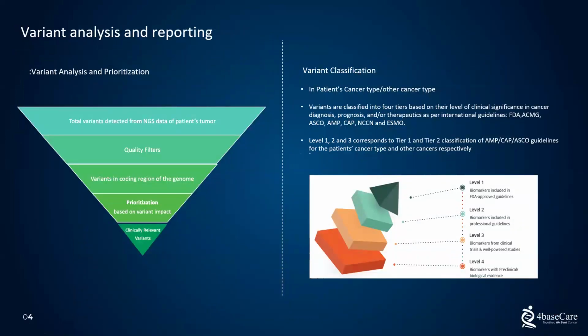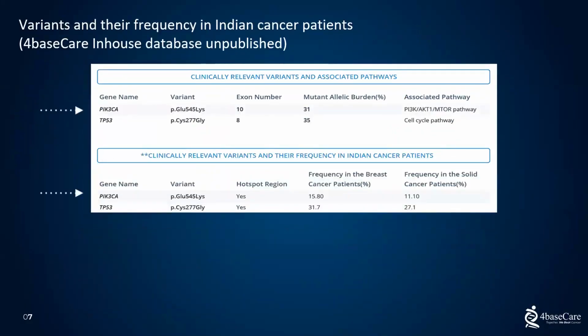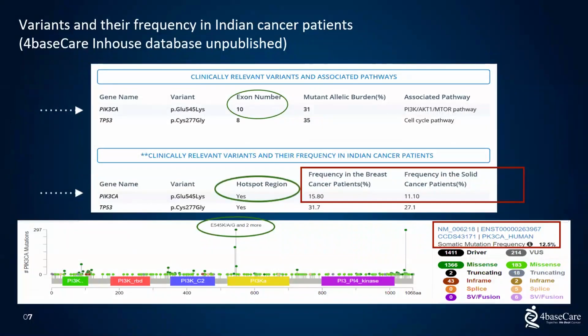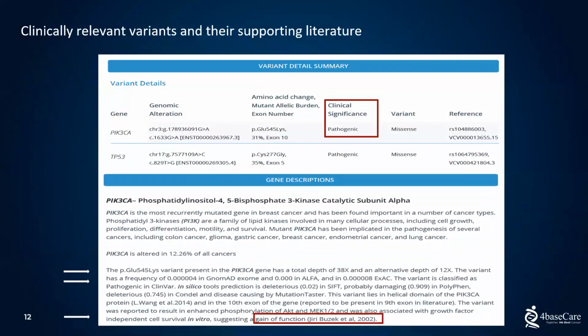So this was something I talked about, the variant prioritization and all. And important elements of an NGS report need to have evidence information about the drugs that one provides. Is it FDA approved? What level of information is available? It's important to remember, notify the exon number, which we discussed earlier, and allele frequency and relevant literature evidence, if any, in a given population, and scientific evidence. And most important is the okay.